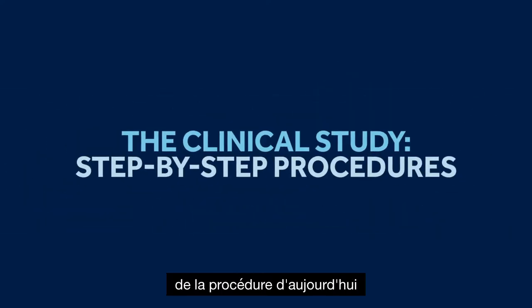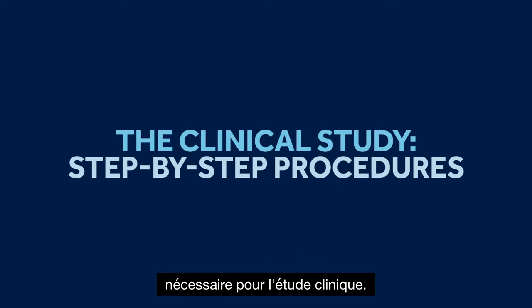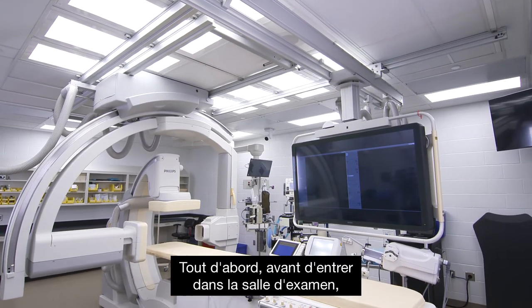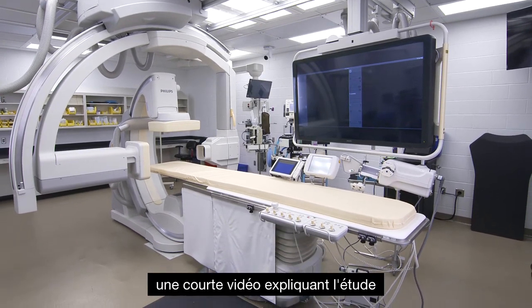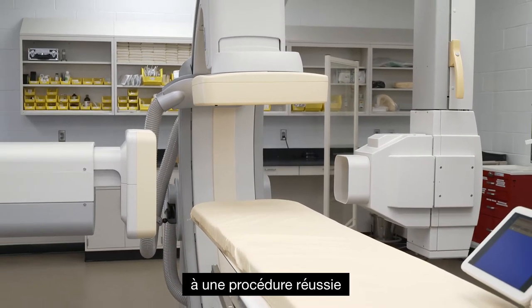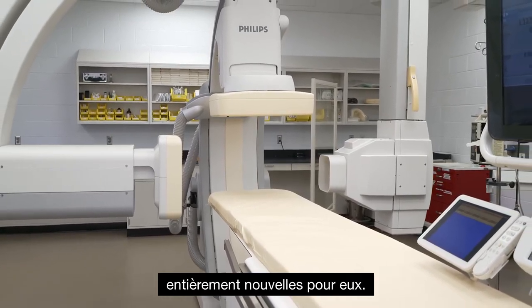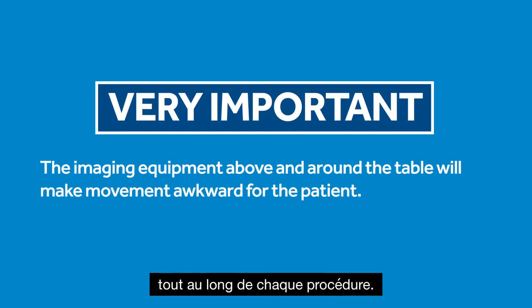Let's dive into the specifics of today's procedure as it relates to gathering information needed for the clinical study. First, prior to entering the exam room, patients will have viewed a short video explaining the study and what to expect during the procedure. Our hope is that this will prepare the patient for a successful procedure, since your instructions will not be entirely new to them.